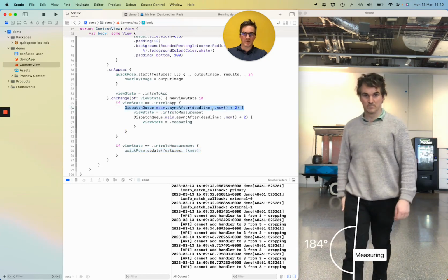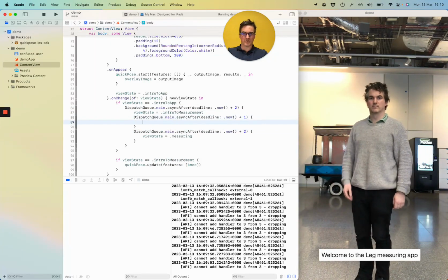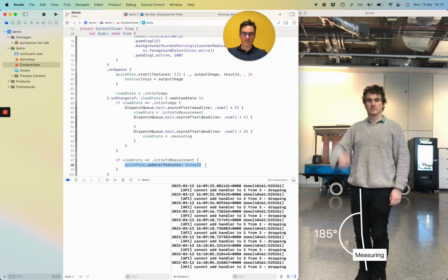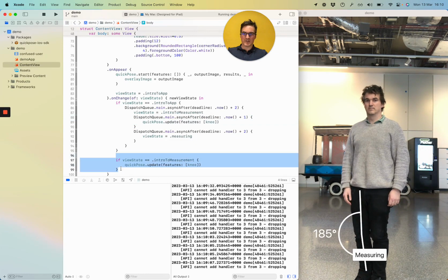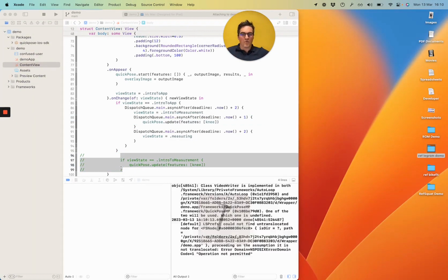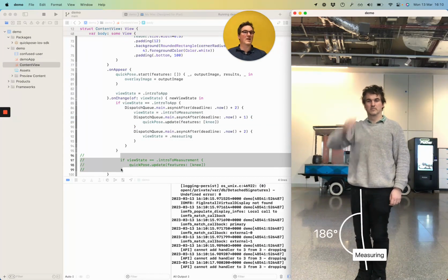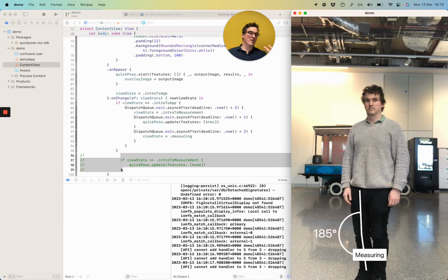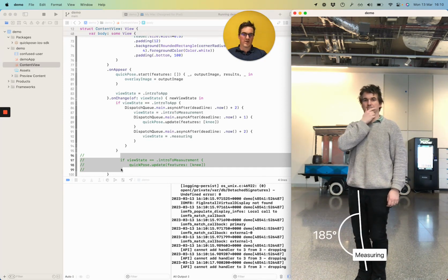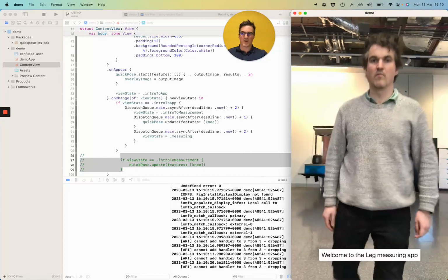So maybe we do this. So after 1 second, we then show the measuring tool. There's a key principle here to introduce one thing at once to the user, progressive disclosure. So please match the pose, and then we get our measuring tool, and then we get the prompt saying measuring. It's still quite fast, but considering the video is pretty limited in what we're able to do with it, I think this is probably good enough for now.